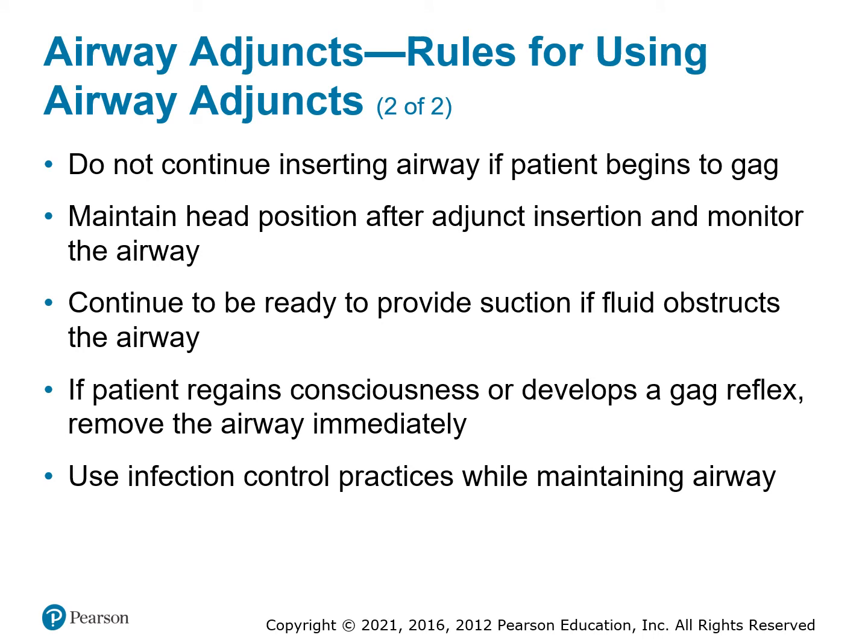For using an airway adjunct, if they start to gag while you're putting in the OPA, stop. Try to maintain head position before, during, and after the airway insertion. The airway has to be monitored all the time. You have to be able to provide suction if there is fluid that starts to develop. If the patient regains consciousness or develops a gag reflex, you have to be able to take the OPA out immediately.